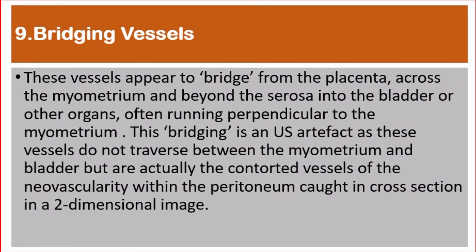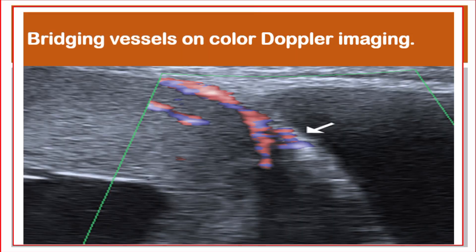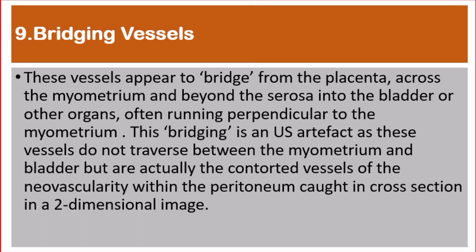Number 9: Bridging vessels. These vessels appear to bridge from the placenta across the myometrium and beyond the serosa into the bladder or other organs, often running perpendicular to the myometrium. This bridging is an ultrasound artifact, as these vessels do not actually traverse between the myometrium and the bladder, but are the contorted vessels of the neovascularity within the peritoneum seen in cross-section in a two-dimensional image.